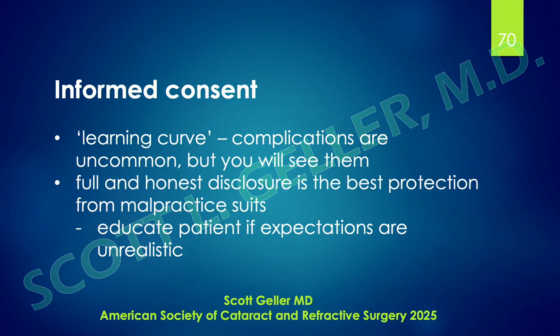And even with a vitrectomy, there's still stuff floating around. So as long as their expectations are realistic, it's easy to proceed. And you can always tell a patient, if we don't get you where you think you'd like to be, you can always have a vitrectomy.